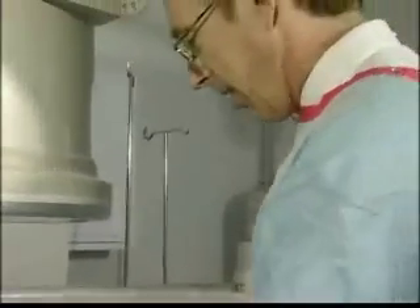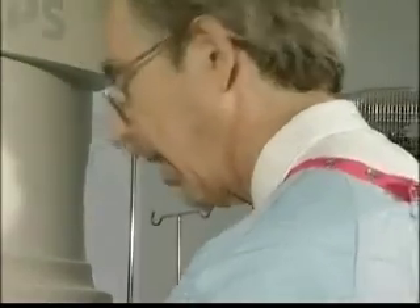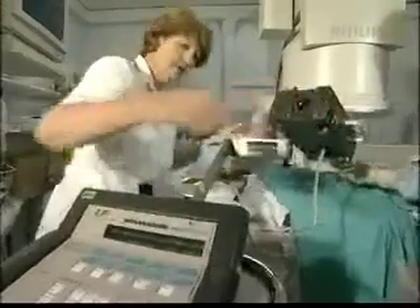What you're going to feel now is just a little sting in the groin. Now I'm going to put the needle into the artery and put the guide wire up through the artery — you shouldn't feel much now. Once the catheter has been inserted, a remote-controlled pump can be used to introduce the contrast medium to the patient's artery.